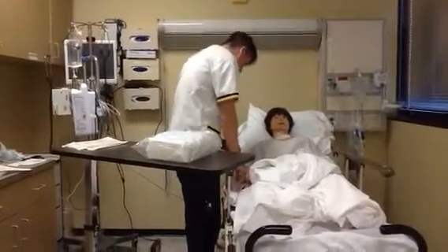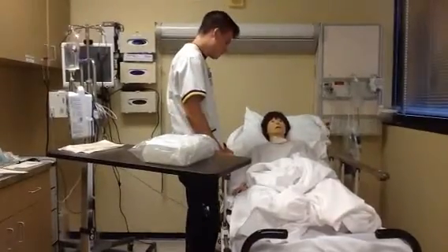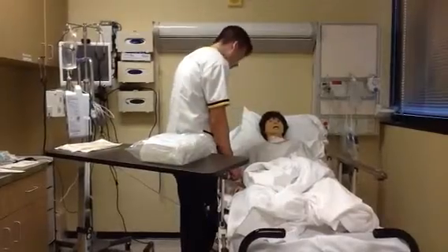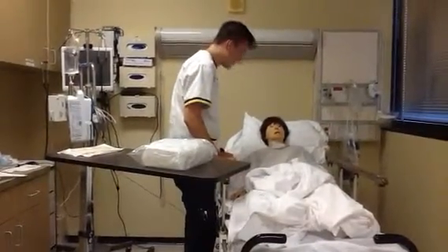Alright. I have Charlene J. Knight, date of birth 8/8/39. Alright, Mrs. Knight, is there any allergies I should be aware of? And I see here you have penicillin, latex, and betadine.